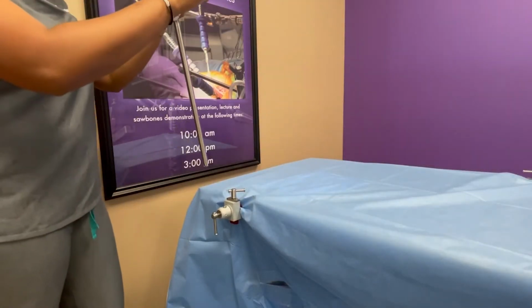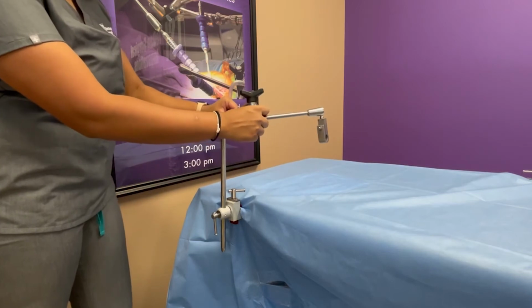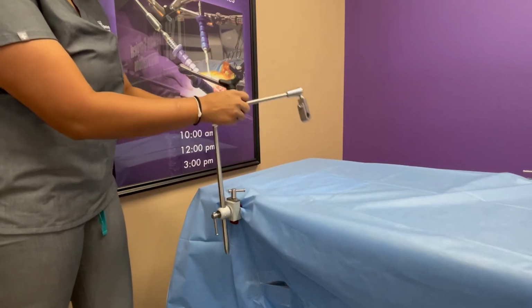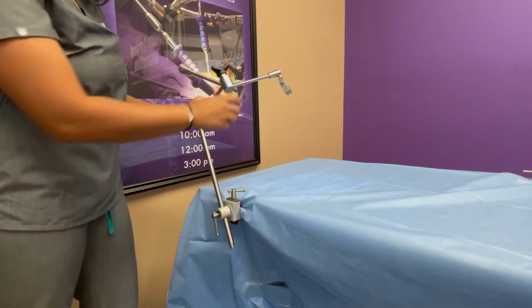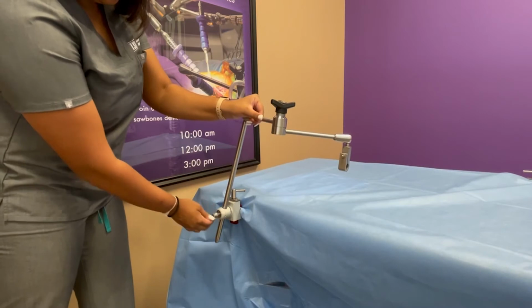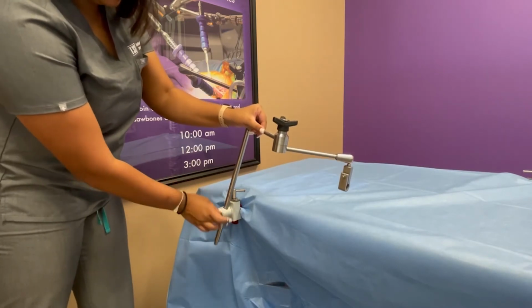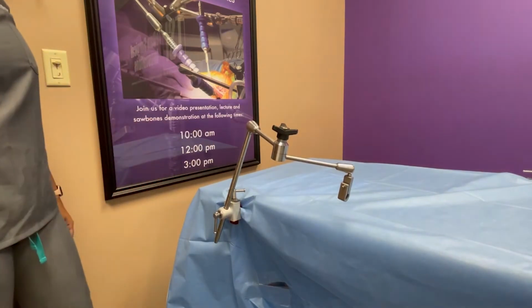Next, you will take the articulating arms and insert them into each of the table clamps. The rotatable feature of this table clamp allows you to rotate the articulating arm to more conform to the patient's anatomy. Once you get it to the angle that you would like, you can clamp it down and tighten the knob to hold the articulating arm in place.